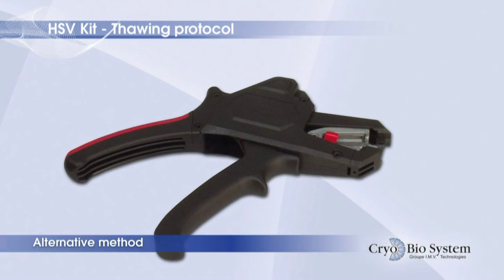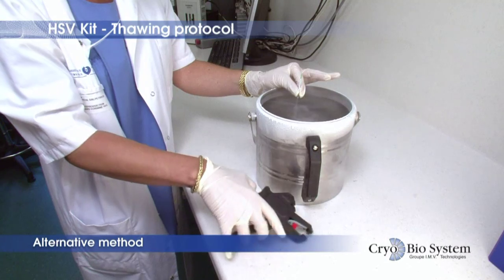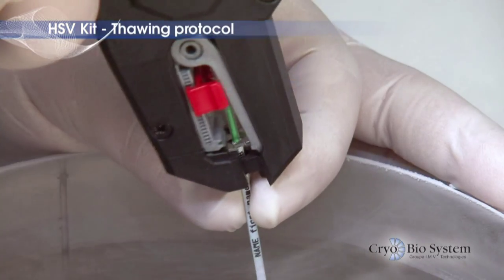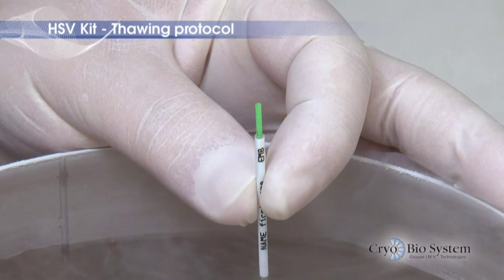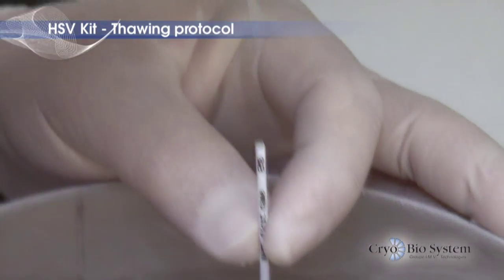A wire stripper can also be used to open the straw. Positioned around the coloured rod and its metal insert, the stripper allows, in one single move, to section the straw around its full periphery and remove the cut part. The coloured rod is thereafter accessible and the rod and capillary can be removed gently from the straw by pulling vertically.